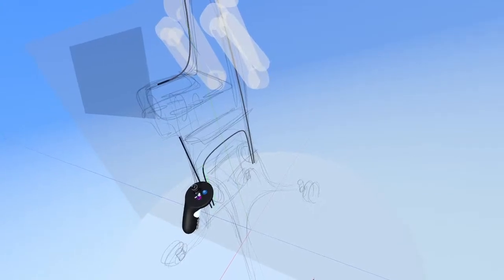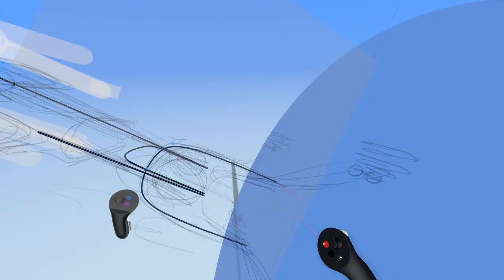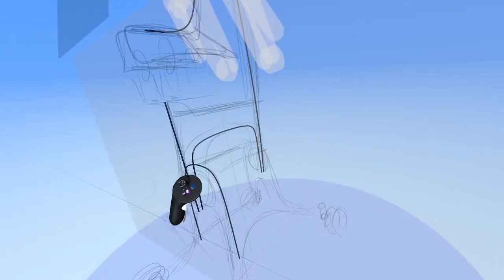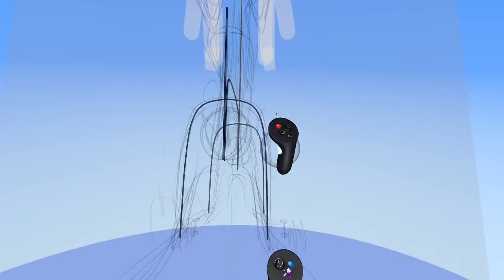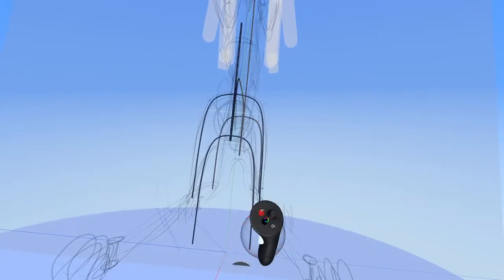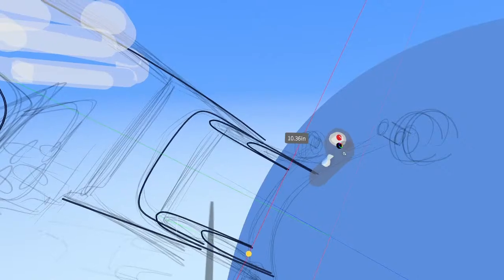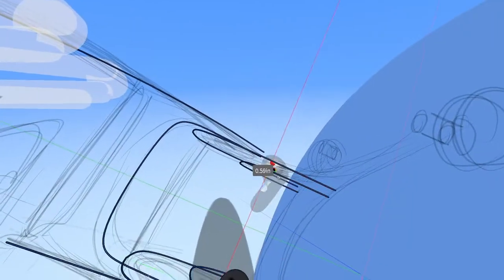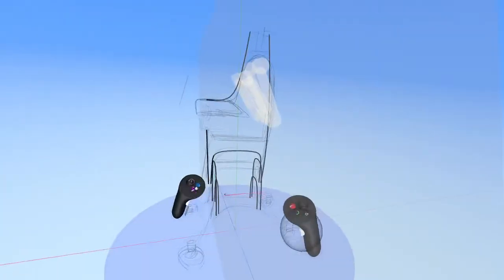And then the next thing I'm going to do is take the plane and snap it in this direction, just like we were doing for those section views, and make the very first part of the leg, and then duplicate this out going that way. All right, and again, like I said before, if you don't need to make more geometry, don't, just duplicate what you have. So I'm going to duplicate that line down, and then of course put it into edit mode, mess around with it a bit like that, and we just saved ourselves some extra work. Actually, this would look better if it was shifted in. All right, that's looking good. Okay, and we'll save that for a little bit.